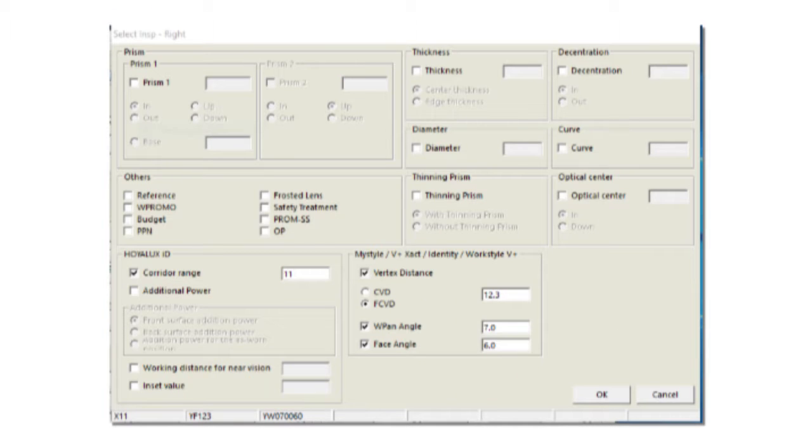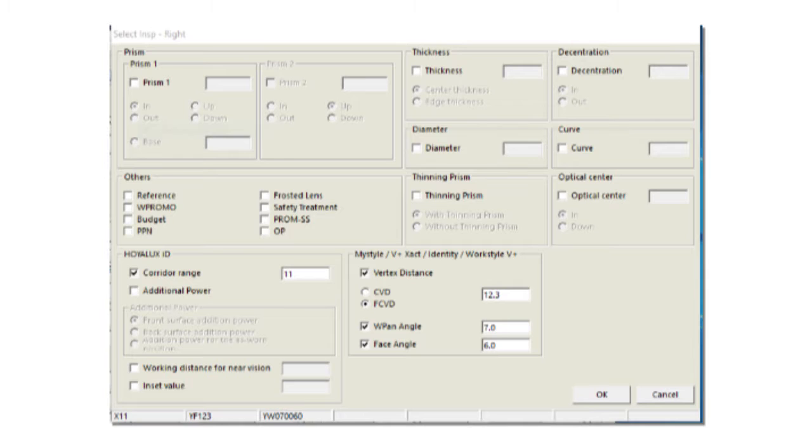The following screen will appear. I want to draw your attention to the lower left hand side corner. When there, you will tick corridor range and to the right of it, you can now input the corridor that you want. 11 millimeters all the way up to 16. As I said, default for short will be 11 and default for long will be 15 millimeters. To the right of it, we'll use the vertex distance. Always choose the option frame corneal vertex distance as shown in the second option and to the right of it, the value.